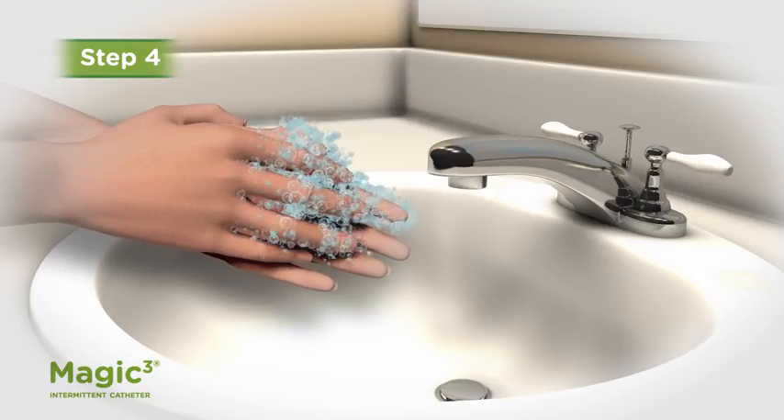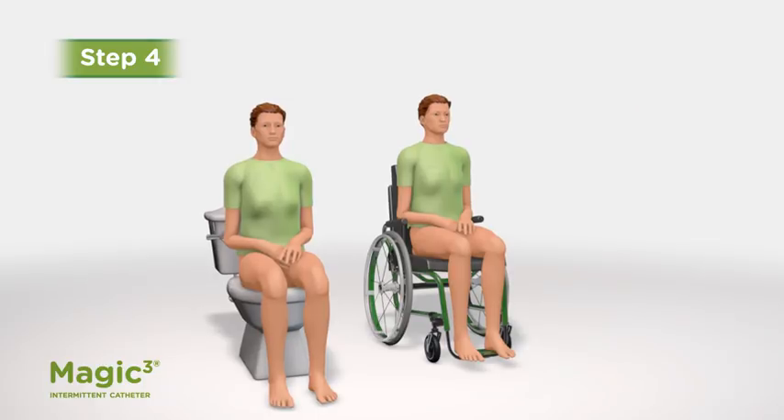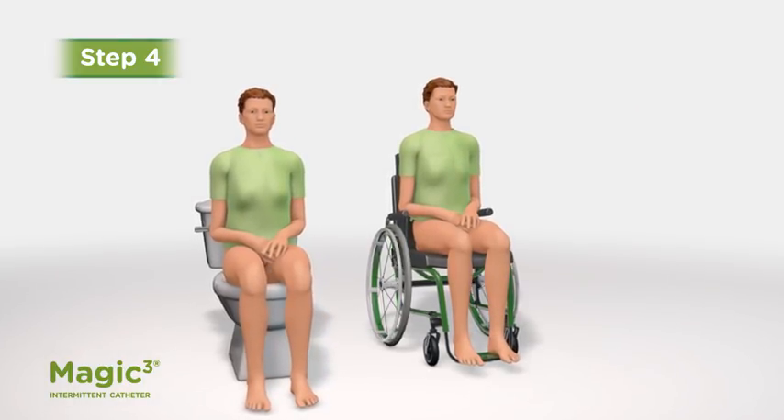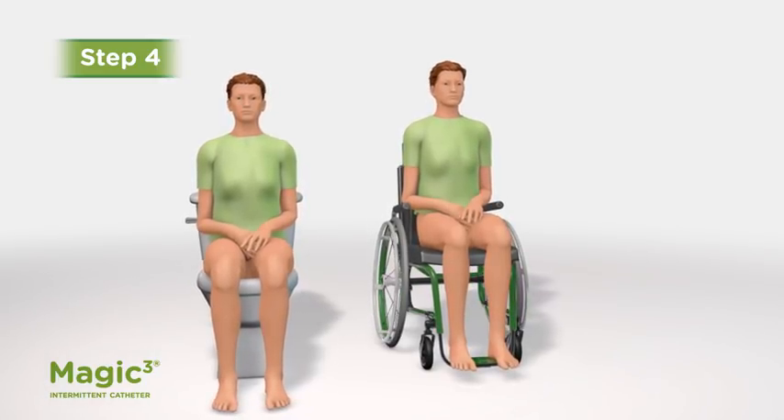Step 4: Wash your hands again with soap and water and dry them. You can insert an intermittent catheter from a number of different positions. Your healthcare provider will work with you to find the best position.